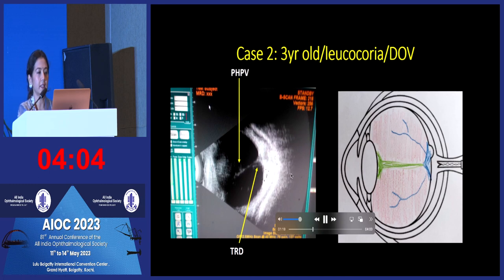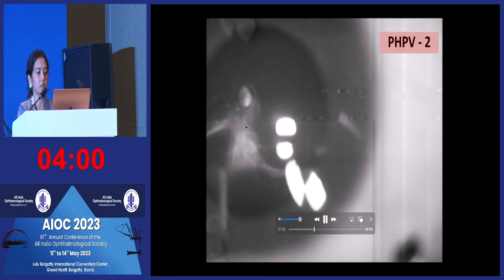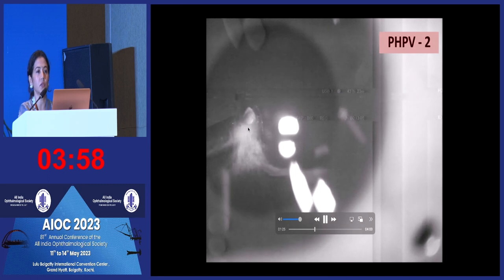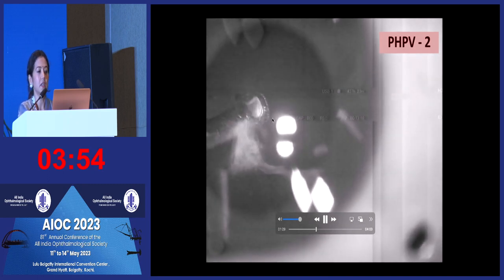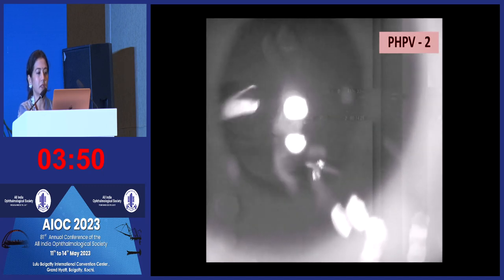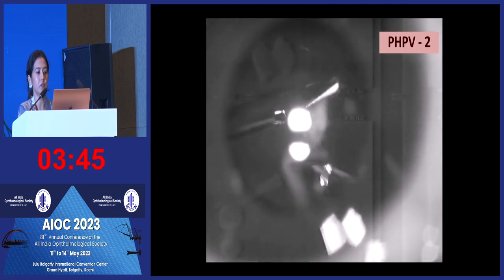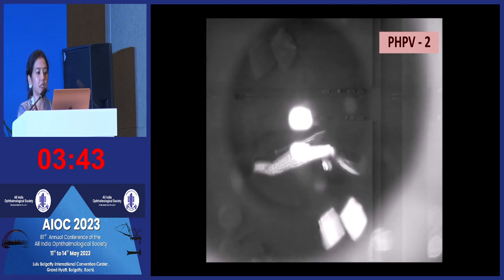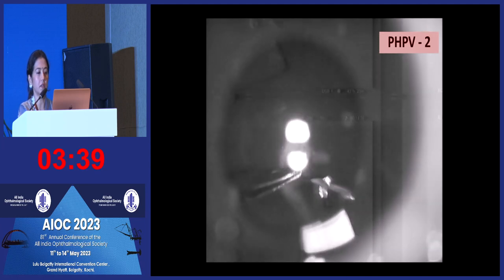This is the second case where a three-year-old, again, the stalk from the disc to the posterior capsule of the lens was there, but there was no cataract. So the challenge in these is to try and retain the lens. So anterior vitrectomy was done, again bimanual under the microscope, where you tease out the membrane from behind the lens, push it posteriorly, that gives you the cleavage point, and then you can just cut it with your forceps.